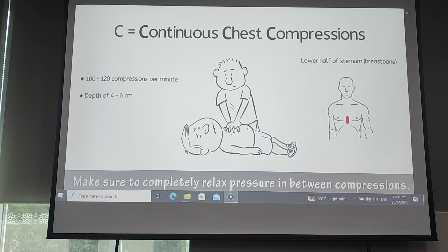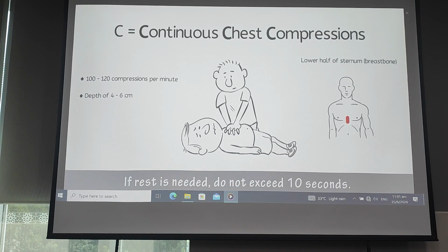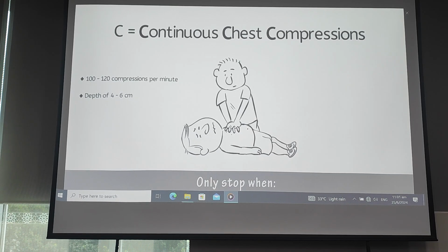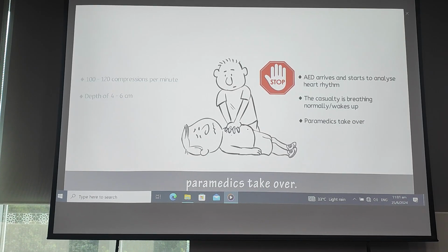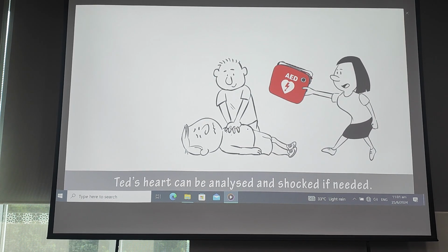Make sure to completely relax pressure in between compressions. If rest is needed, do not exceed 10 seconds. Only stop when the AED arrives and starts to analyze heart rhythm, the casualty is breathing normally and/or wakes up, or paramedics take over. Arrival of the AED means Ted's heart can be analyzed and shocked if needed.